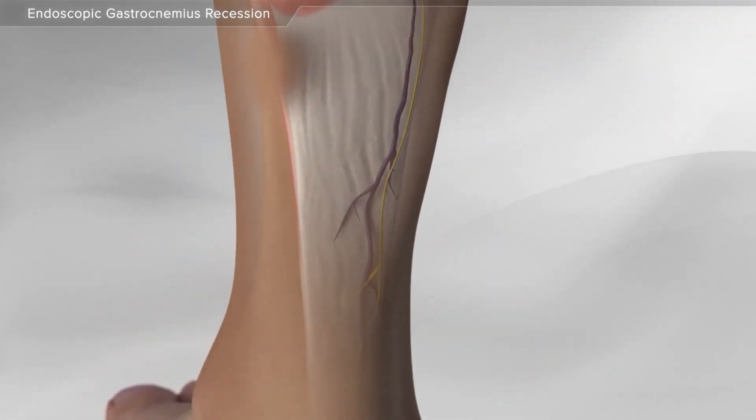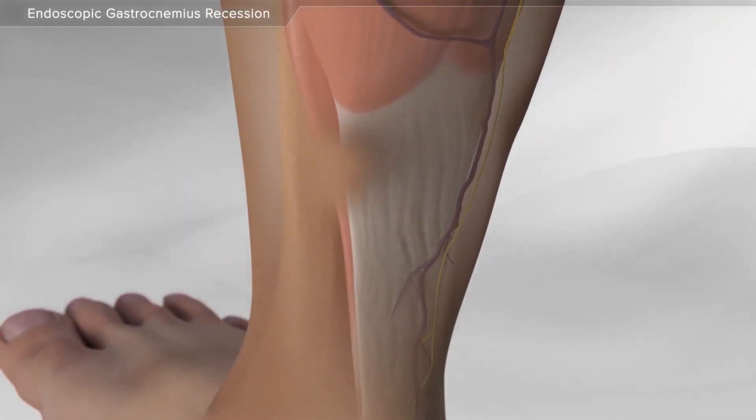The procedure is for a condition where the foot is not able to come to a neutral position, resulting in the patient looking like they are walking on their toes. The common cause is due to a tight calf muscle or gastrocnemius muscle.